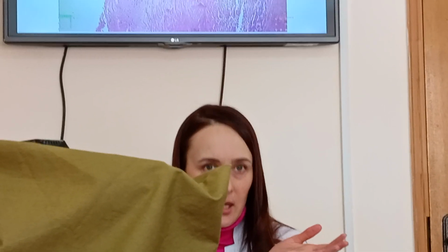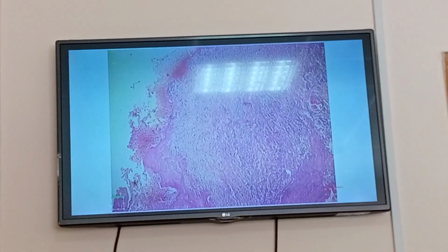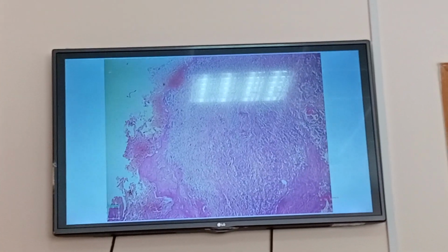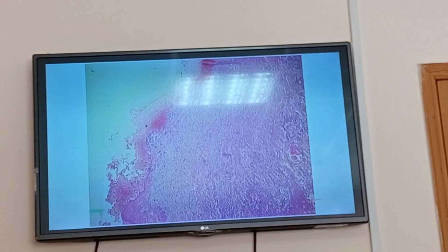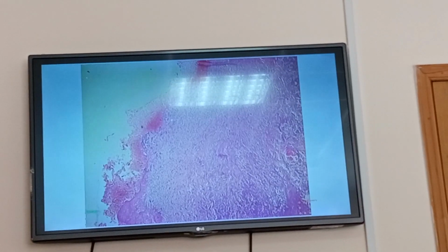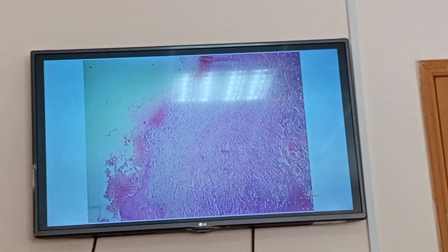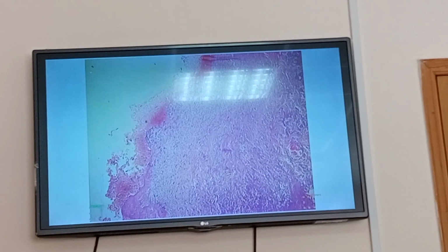On this plate we can see accumulation of platelets, fibrinous necrosis, and infiltration by inflammatory cells. So these are vegetations with platelets, RBCs, thrombus formation, and inflammatory cell infiltration. Purple color is infiltration by inflammatory cells and also microorganisms accumulation. Pinkish color, platelets and fibrinous necrosis. Valvulitis. That's all.